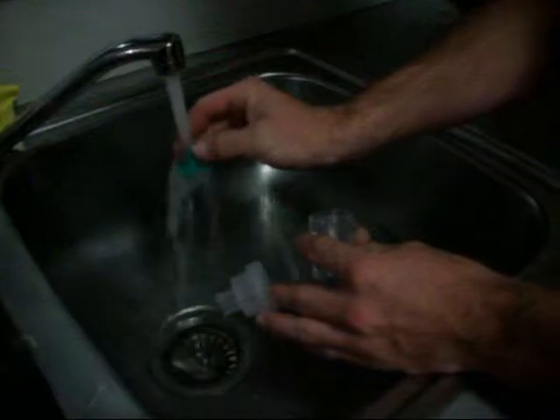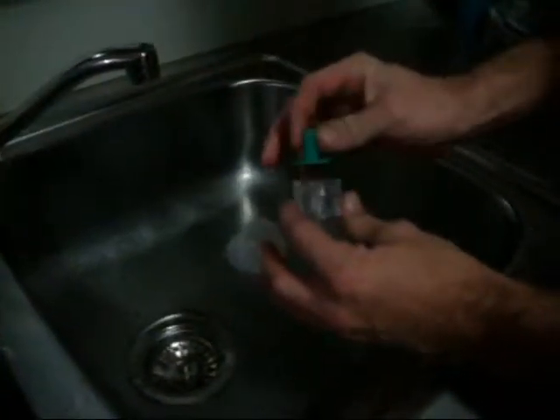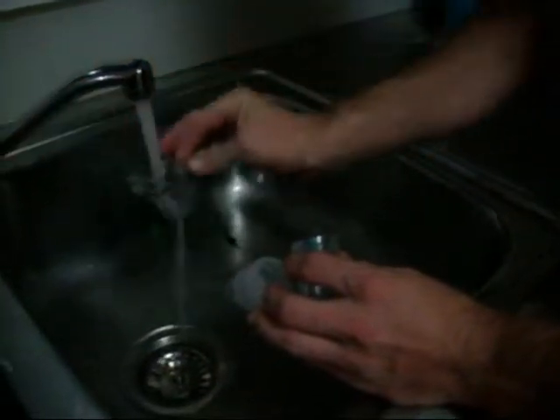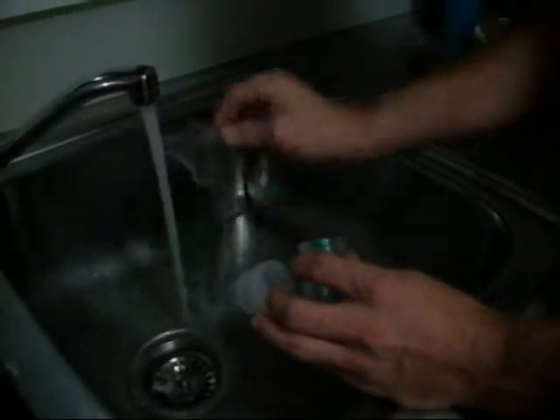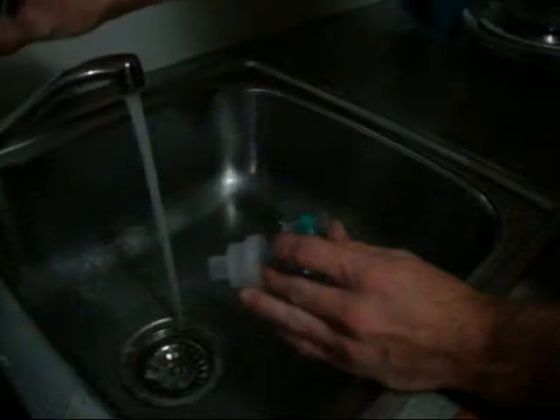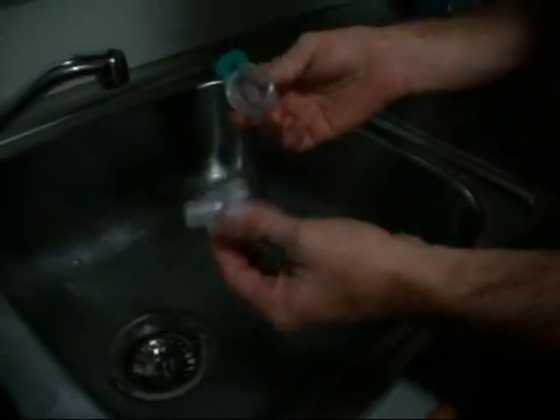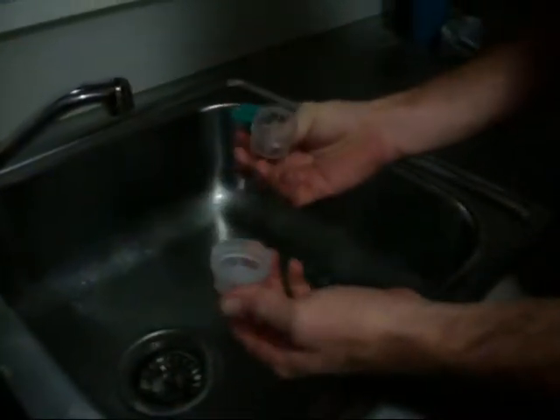In some environments, it is a good idea to also have the items sanitized before being returned to the same patient. Ensuring there is no water or liquids of any kind left in the devices will help prevent mold and other residue.